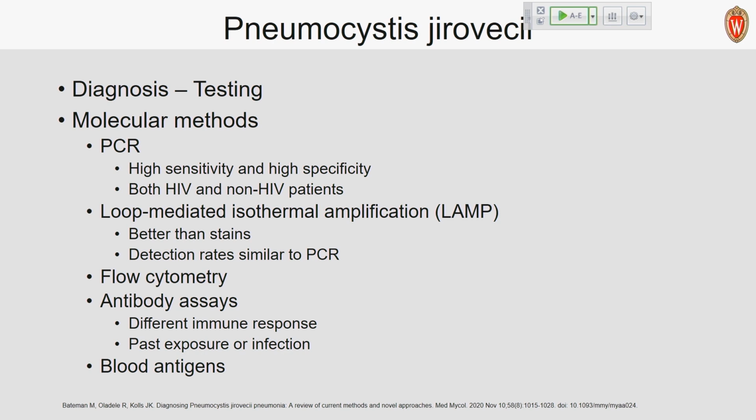Yeah, we used to do the fluorescent stain in-house. We stopped that, I want to say sometime around 2019, 2020, and we now send it out for molecular to a referral lab. But when we did do it in-house, St. Vincent's was always kind enough to share positive controls with us, because that is one of the problems related with this assay for fluorescence: finding a positive control, because there really wasn't anything out there from a vendor perspective. So we always shared positive controls with St. Vincent, so we were appreciative of that. But I would say even with that, the stain could be difficult to interpret even with a positive control. Okay, cool. Thank you.